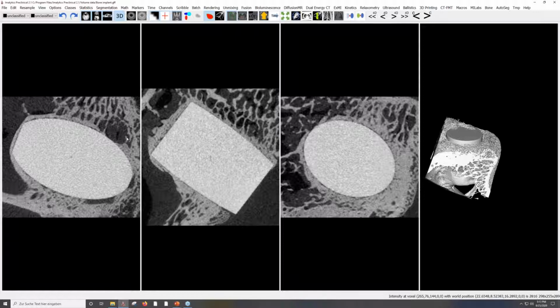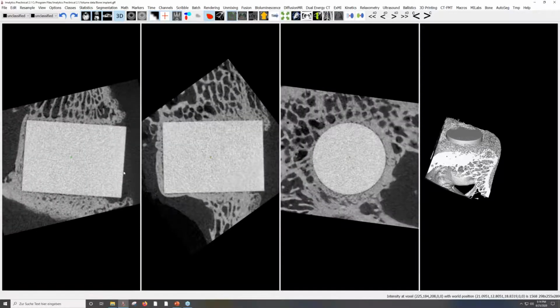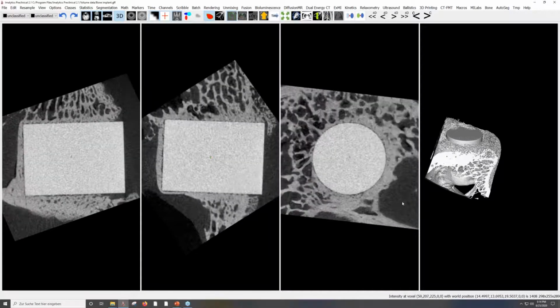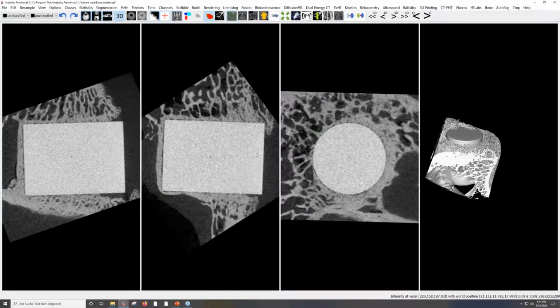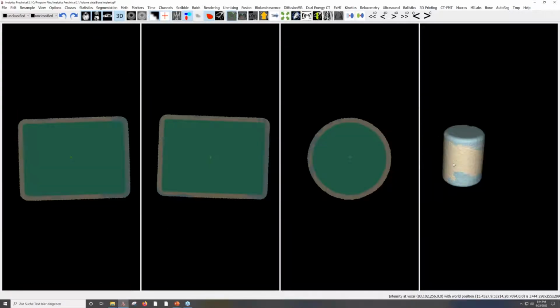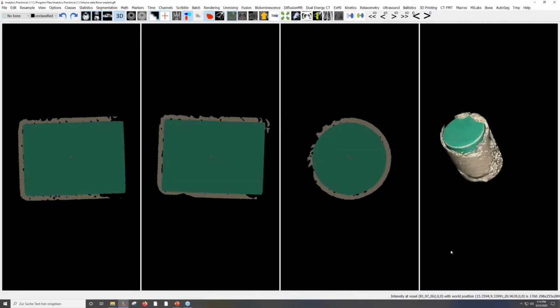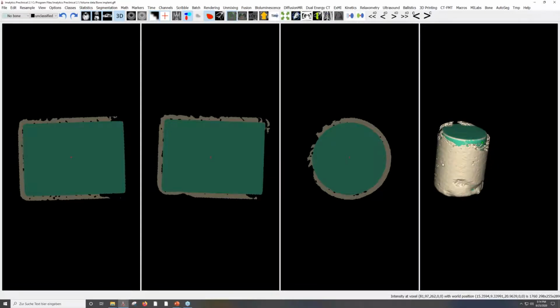What you can do is first rotate it straight, and then you will see that it is a cylinder. It's just changing the views here, and then using a segmentation, like a sequence of first thresholding to generate the implant, then you coat it, and then apply a thresholding on the coating, then you get the bone on the surrounding, then you can quantify the percentage of grown bone around it. So this is around, I guess, 70% covered by bone, and that would be your quantification result.